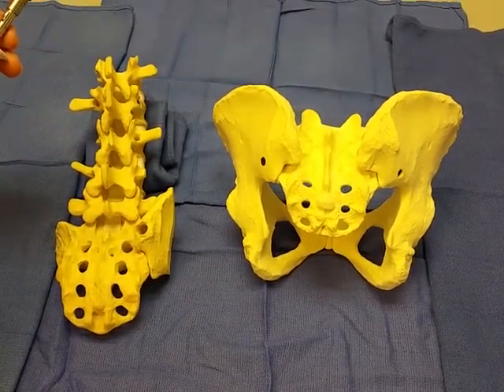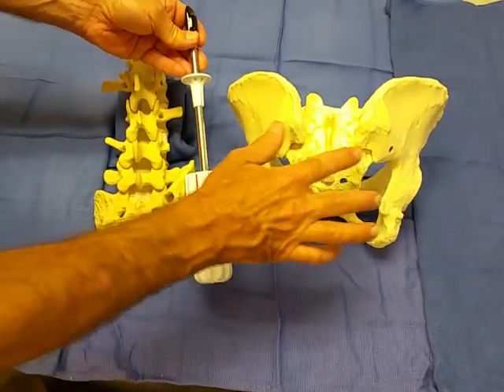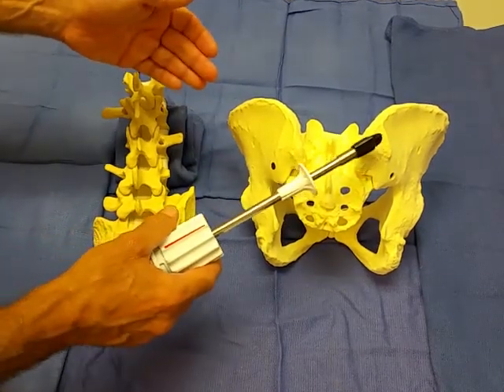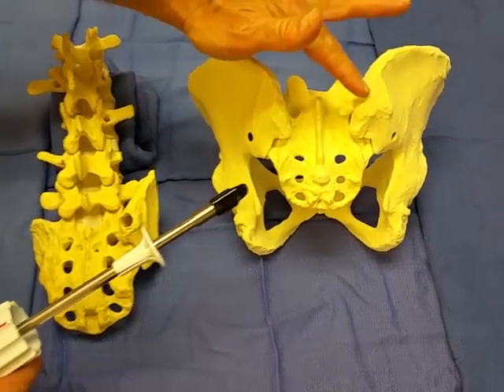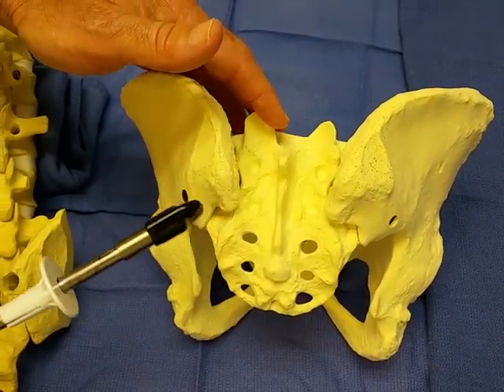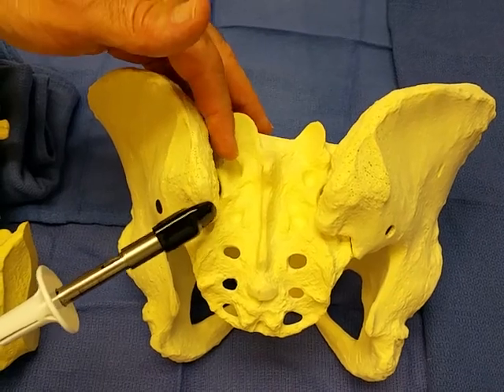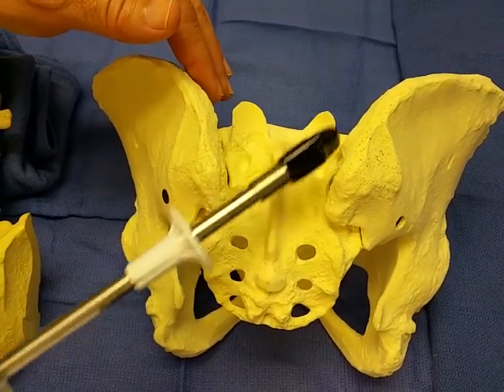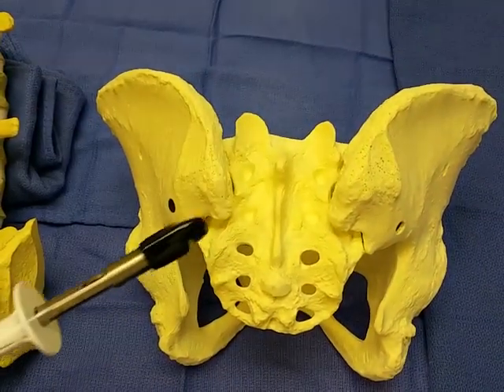We're going to demonstrate the use of the Corex device for harvesting purposes of the posterior superior iliac spine region. This structure can be palpated subcutaneously — it's a subcutaneous accessible structure. There is no fascia immediately superficial to the posterior superior iliac spine. The gluteal muscles attach along an aponeurotic attachment to the rim, and your erector spinae muscles and sacroiliac ligaments attach medial, but immediately superficial to the posterior superior iliac spine is just subcutaneous fat and skin.